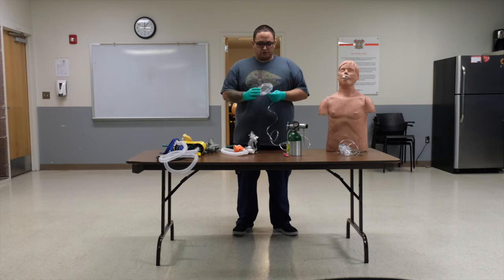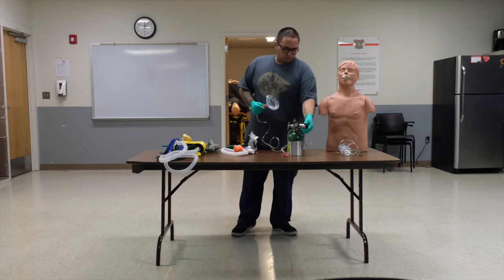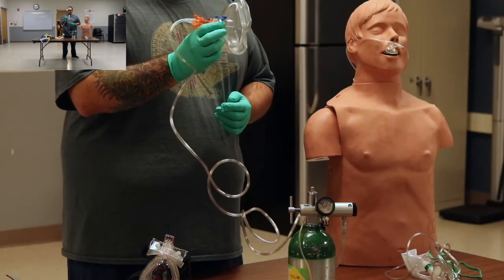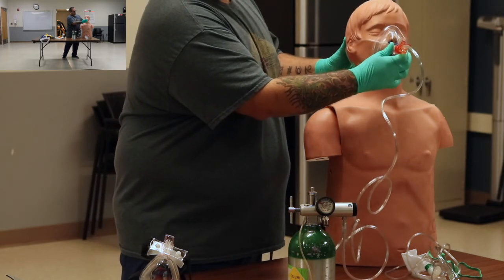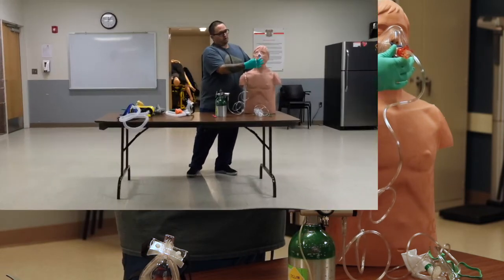So same way with introducing it to the patient, you want to make sure that you explain to them what CPAP is, what it does, explain that it's going to be a little bit uncomfortable. But as you are setting it up, same thing, the mask itself is equivalent to a BVM mask. So we want to make sure that we introduce the patient to it, we want to make sure that there's a good seal, and that they're tolerating it before we secure it.